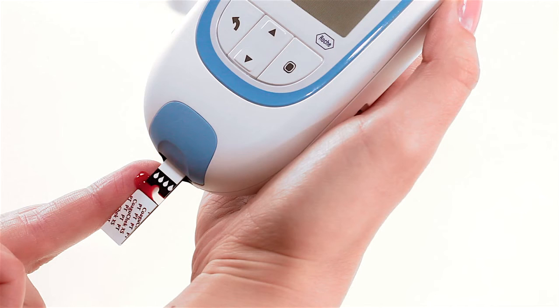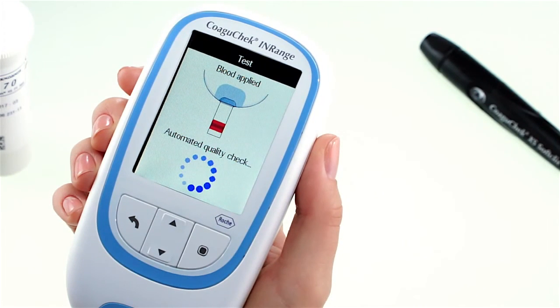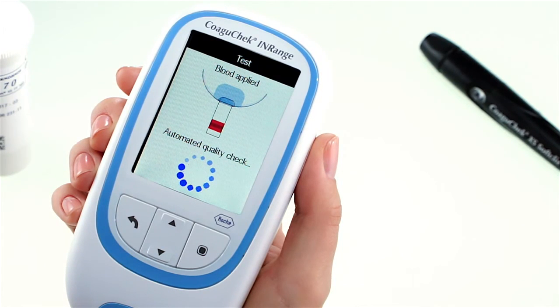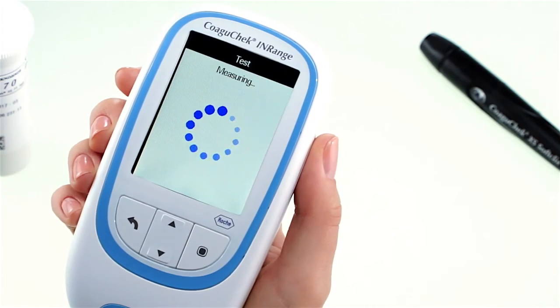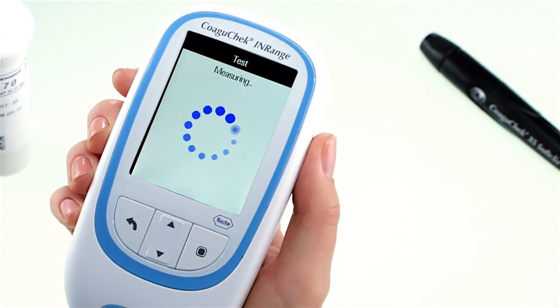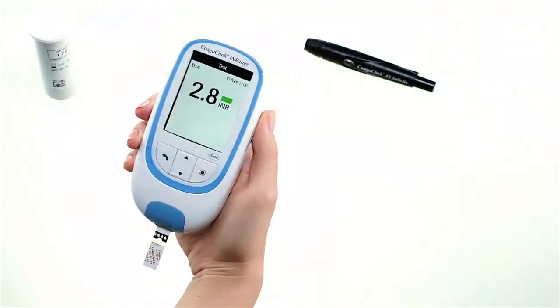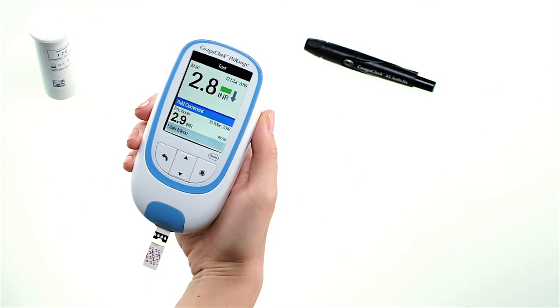When enough blood has filled the strip, the meter will let you know by beeping. The blood drop symbol disappears and the test starts. Do not touch the test strip until the result is displayed. In the background, the meter performs an automatic quality control check of the test strip and the coagulation measurement starts. The circular indicator lets you know when the meter has determined the result, and the result is then displayed.